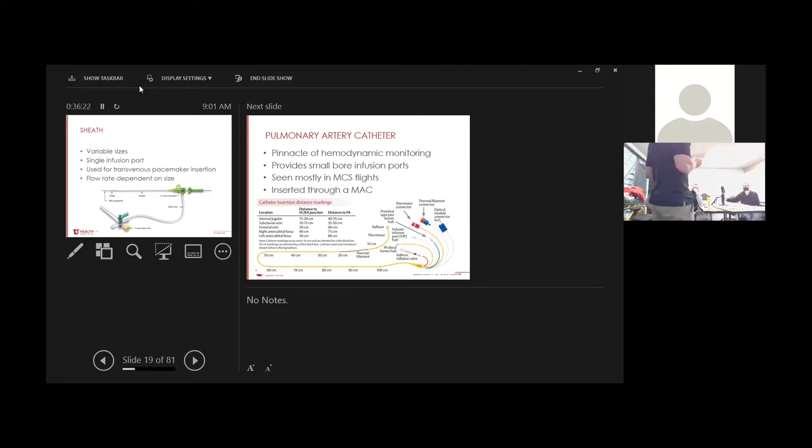And again, they can be used during procedures in the femoral vein. They can be used IJ, but they're also used in the cath lab, in the radial artery, the brachial artery, the femoral artery. So if you see this configuration, you cannot assume it is venous. And if you're going to use it to infuse, you absolutely need to confirm it. Get verbal confirmation, and I would argue you need to transduce it as well. If it's an IJ, unless it's a neuro patient, it's probably going to be venous. But in the groin, all bets are off. And the wrist is always going to be arterial. Just be really careful, remembering that these lines are used for a variety of reasons in a variety of vessels, and you want to make sure you're not using an arterial line.